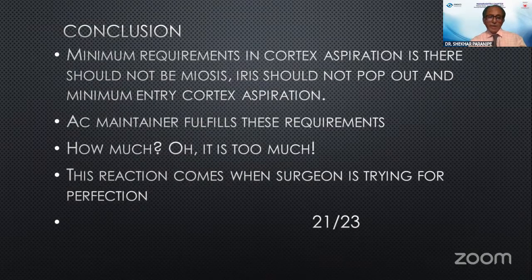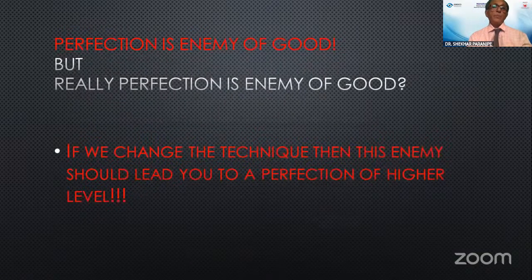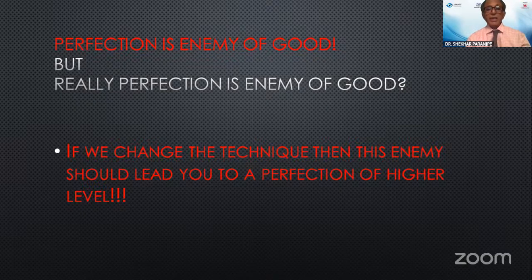Secondly, whenever we are observing another surgeon's surgery, we always say, oh, how much he is doing, it is too much. This reaction comes when the surgeon is striving for perfection. So perfection is sometimes the enemy of good. But is it really so? Is perfection really the enemy of good? If we change the technique, then the enemy should lead us to a perfection of a higher level.